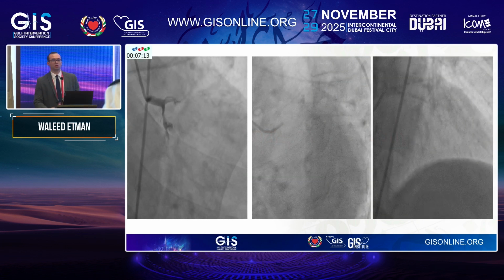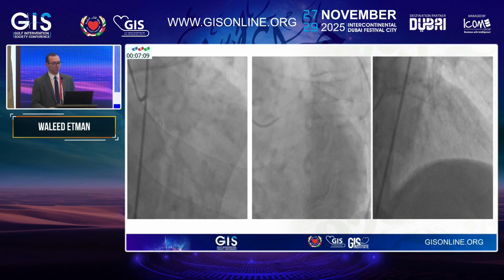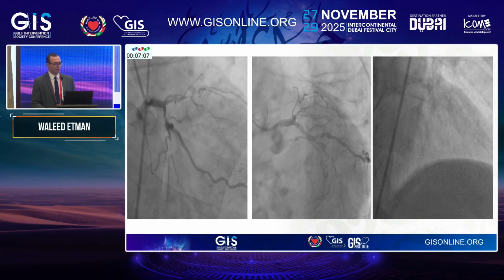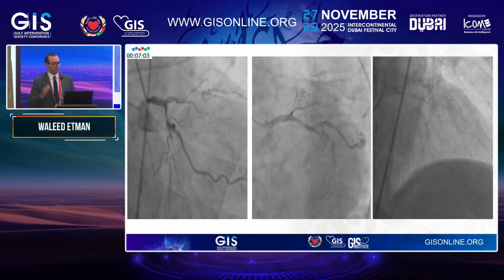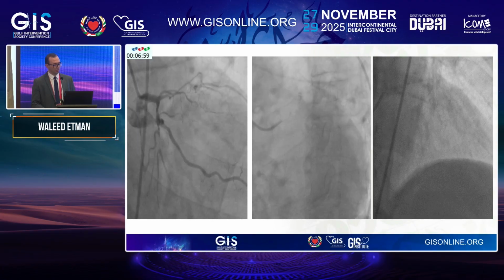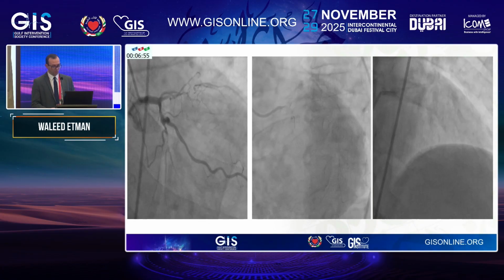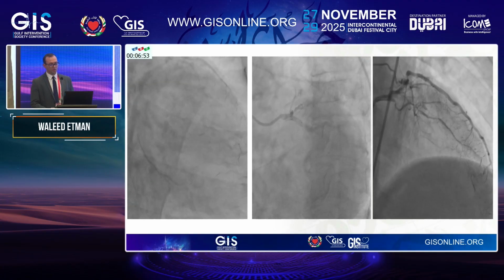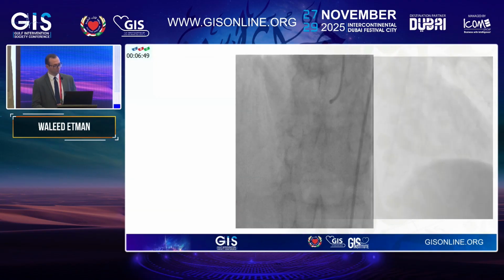So this is his coronary angiography. As you can appreciate here, we have a heavily calcific CTO in the LAD, proximal LAD. We have a CTO in the mid-circumflex, a bifurcating lesion down in the circumflex, and a lesion at the proximal obtuse marginal. We can appreciate it in this spider view. We can appreciate also that the segment lost in the LAD was a very long segment.